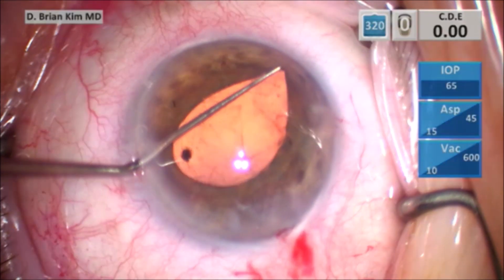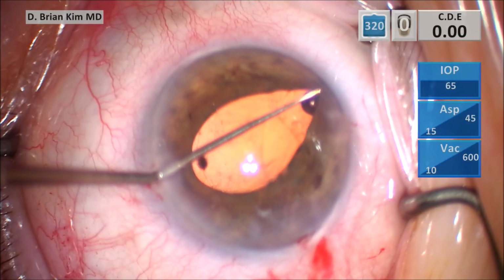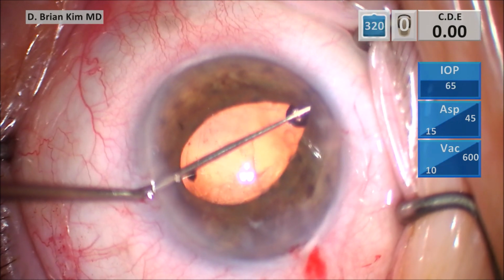It's not completely obvious where the tear is until I retract the pupil right about there. You can see that there is an anterior capsule tear in that area. However, there's no propagation of the tear towards the posterior capsule.